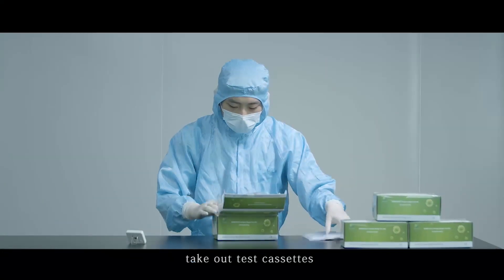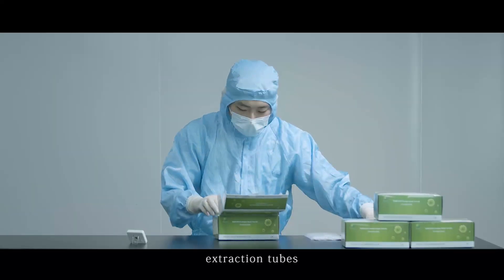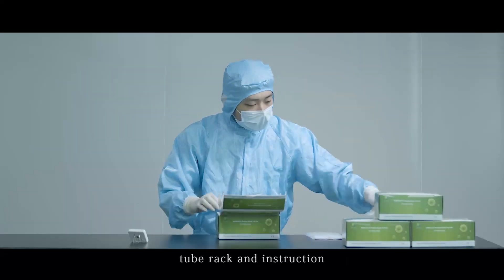Open the gate. Take out test cassettes, swabs, buffer, extraction tubes, tube rack, and instructions.